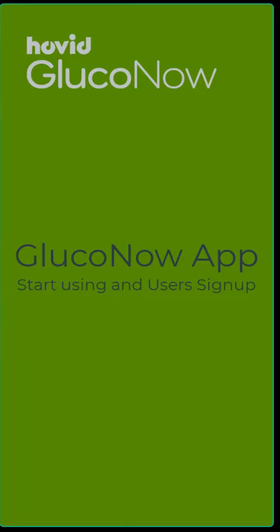Hello, in this short video we'll show you how to start using the GlucoNow app and sign up for the service.